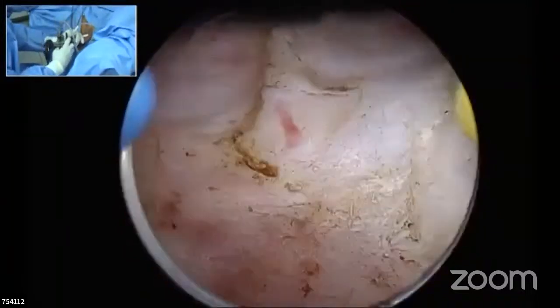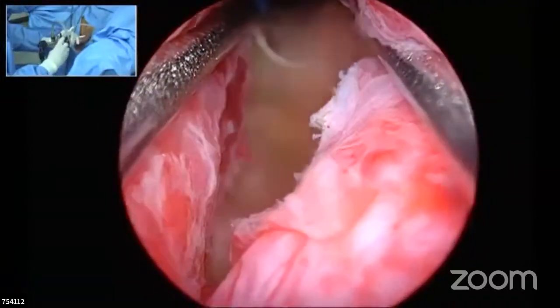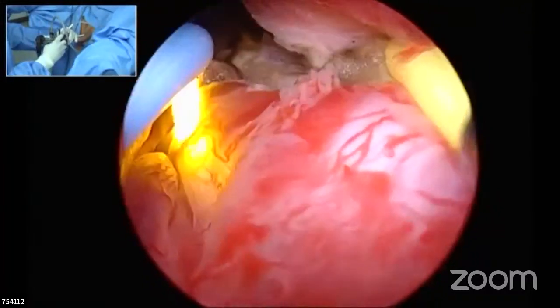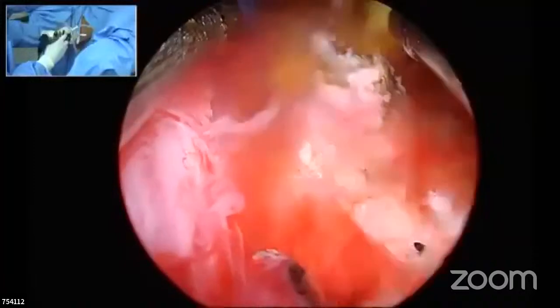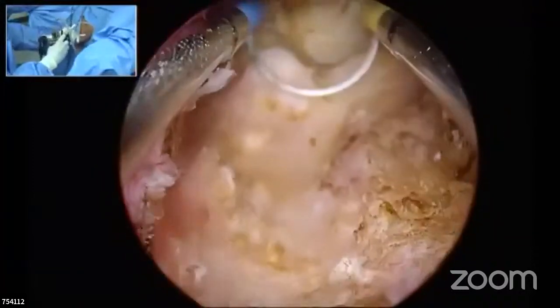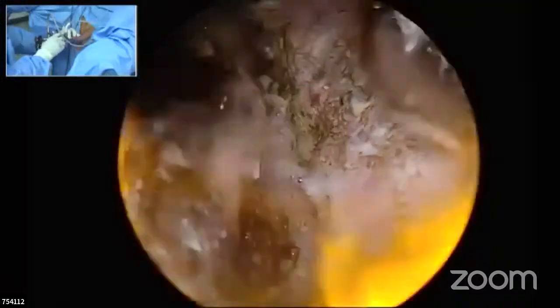What is necessary? That is necessary only when you attempt large, big glands. So when an extended loop is there, you're going to cut it like this and move around and come back and see that your whole prostatic tissue comes as one chip from the bladder neck area till the verumontanum. So I don't think that sort of resection is necessary for most of the smaller glands. That sort of thing possibly is necessary only for a big gland.